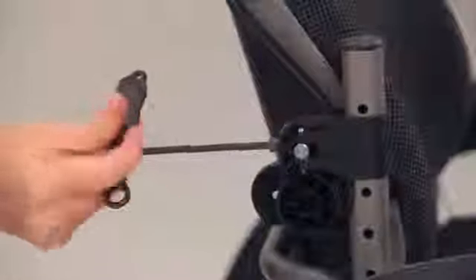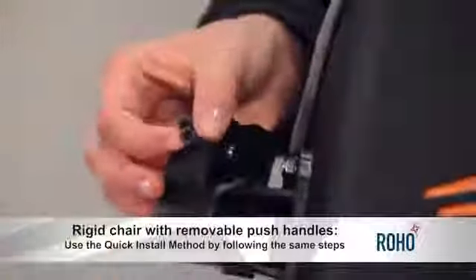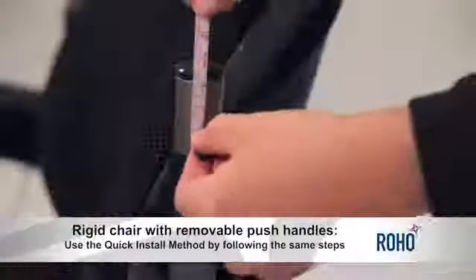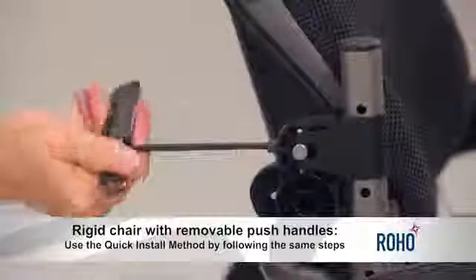Measure the height of both back cane bands with a tape measure and adjust as needed. Use the wrench provided to tighten the hardware bolts until snug, plus a 1/4 turn. That's it. If the rigid chair has removable push handles, you can remove the push handles and use the quick install method by following the same steps.